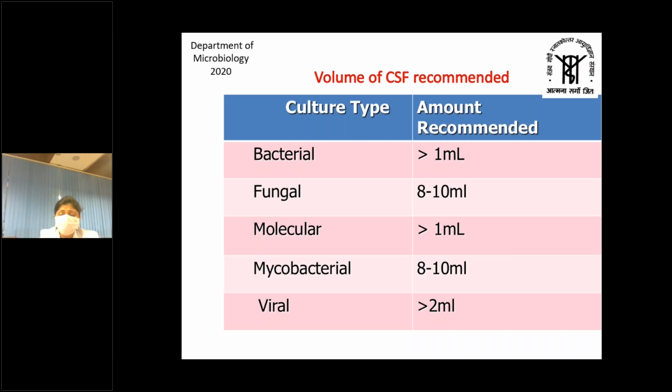To avoid contamination, it is better that you raise separate forms for the various sections. If you want to send CSF for both fungal as well as TB culture, then please let us divide the sample aseptically and we will send it to the various sections.